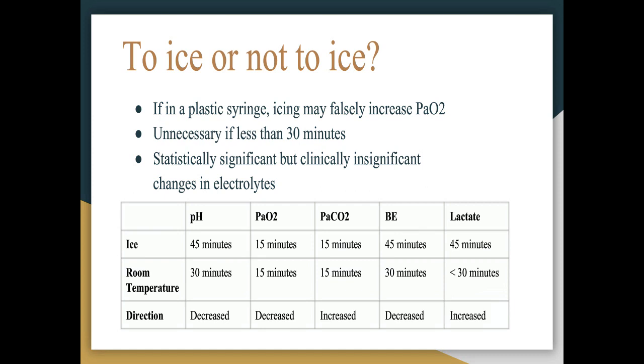Importantly, lactate increases rapidly when not cooled. It increases on average by about 0.36 millimoles per liter over 30 minutes, or 0.01 millimoles per liter per minute. Indeed, a significant difference was noted within 5 minutes between icing and not icing, and therefore uniced lactates should be processed as quickly as possible.